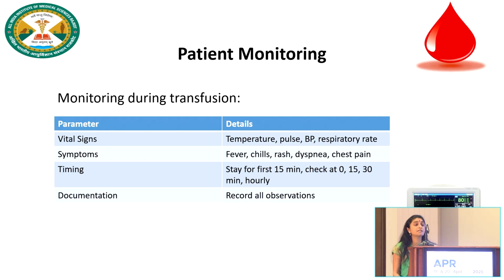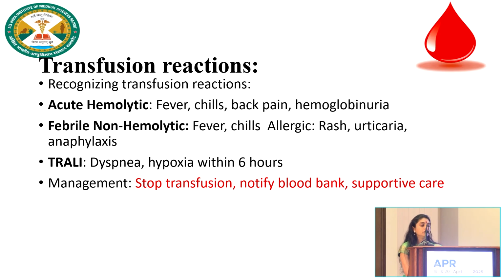There is a regime at certain hospitals or clinics where they give IV anti-allergics before initiating the transfusion. But as a transfusion expert, we would request to refrain from this practice because there are various minor reactions which will be overlooked or masked if any anti-allergic is given pre-transfusion. Documentation, of course, is mandatory. All of it has to be monitored and documented.